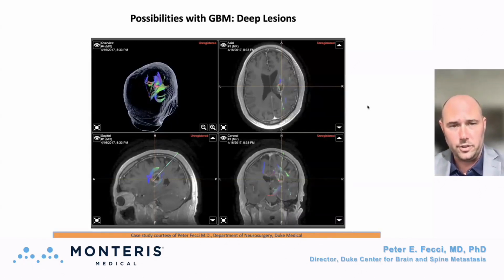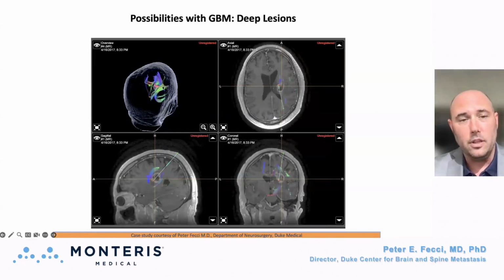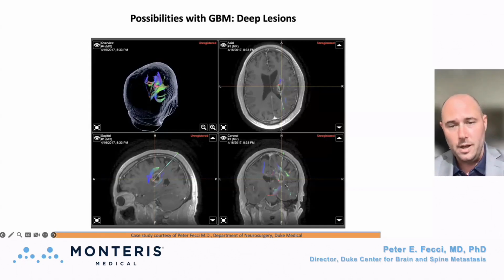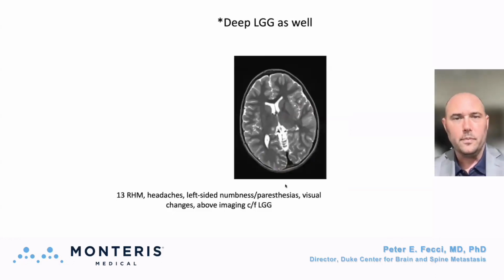You can see the arcuate fasciculus here, see the corticospinal tracts, but you can also see that there's a really narrow window that you can thread the needle here, and that's the threading of the needle you would do with a biopsy needle to safely get in there to get a specimen. And again, you can simply swap out that biopsy needle for a laser catheter. This is a lesion that's small enough to easily be covered with a laser ablation, and you don't offer the risk of an open surgery in this patient, and yet give that patient the cytoreduction that they need.